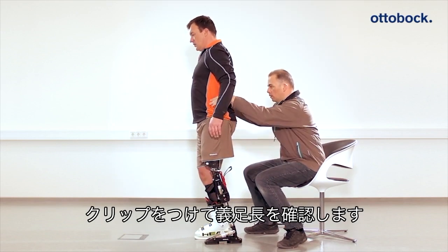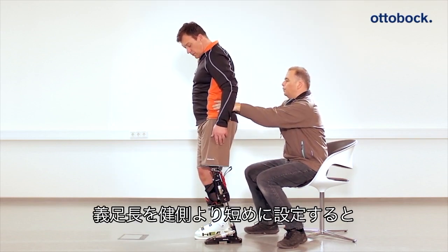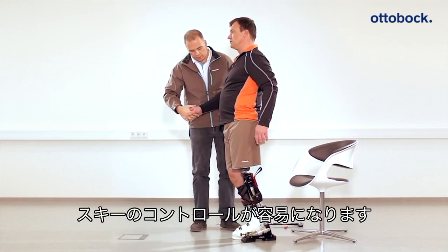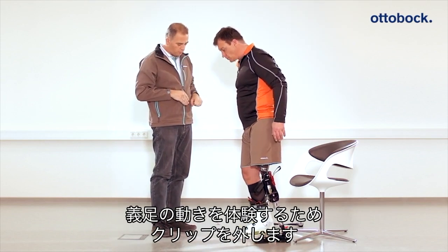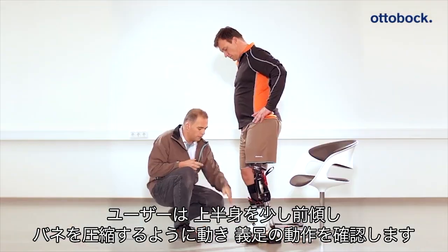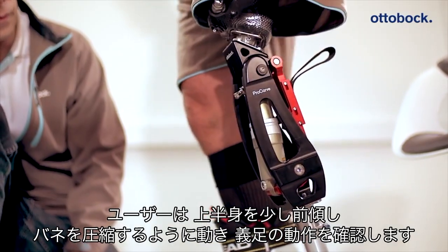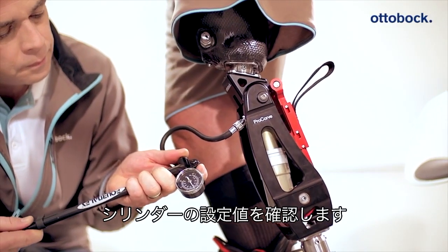Check the height of the prosthesis. The transfemoral prosthesis should be shorter than the intact side to make it easier for the user to ski. To allow the patient to get used to the spring movement in the ProCarve knee joint and foot, please remove the blocking clip. The patient should now practice deflecting the spring, leaning the upper body forward slightly. Then check the recommended basic values on the hydraulic cylinder and the pneumatic system and adjust them if necessary.